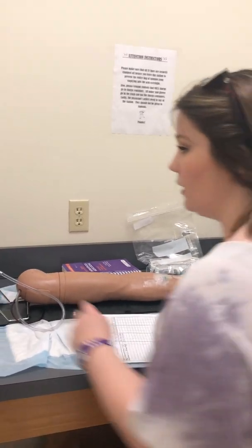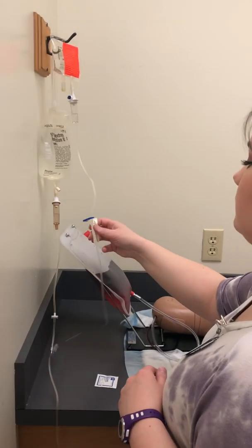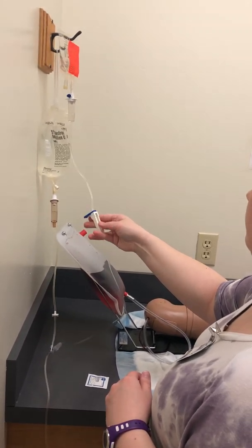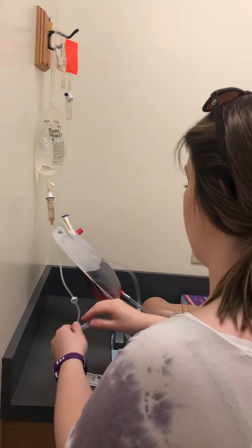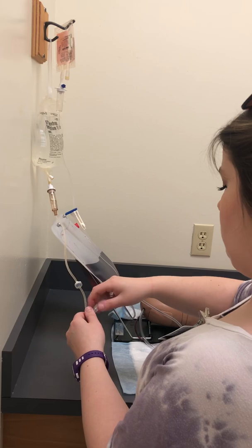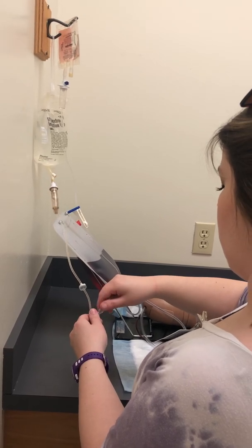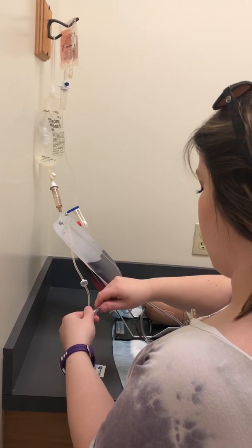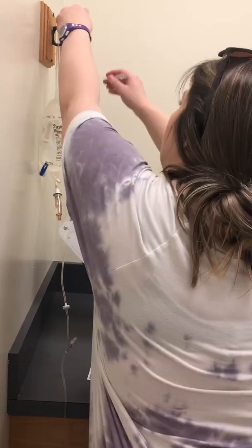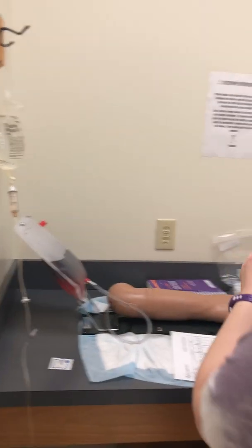All right, now that this infusion is done, I'm gonna clamp this all the way down. I'm gonna unhook this. Okay. Take this down, dispose of it properly.